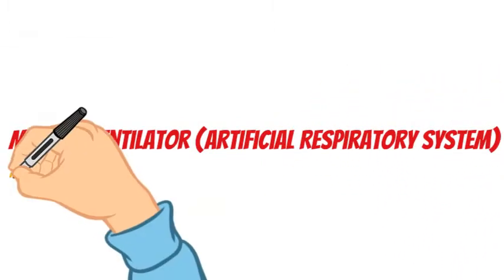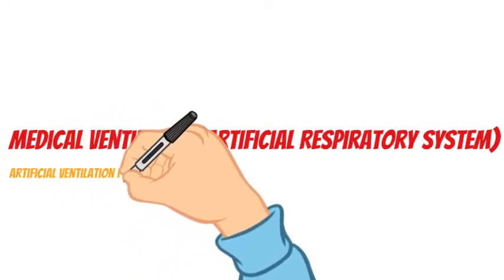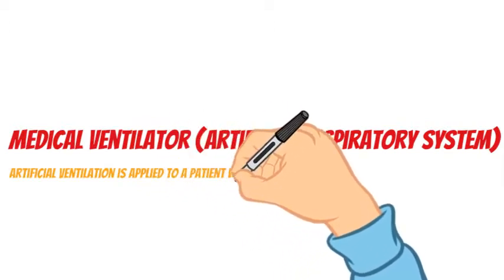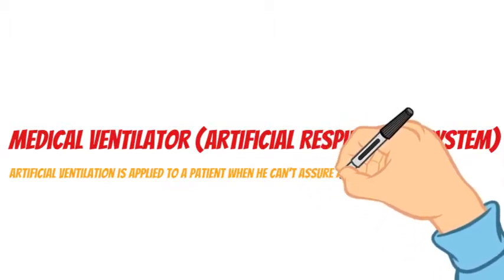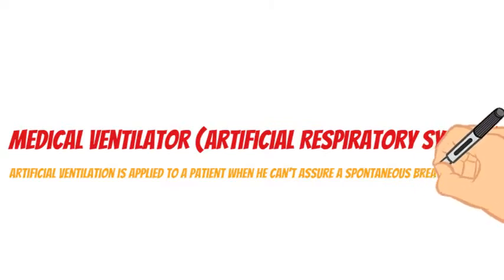A mechanical ventilator is a machine that helps a patient ventilate when they are having surgery or cannot breathe on their own due to a critical illness. The patient is connected to the ventilator with a hollow tube, an artificial airway, that goes in their mouth and down into their main airway, or trachea.